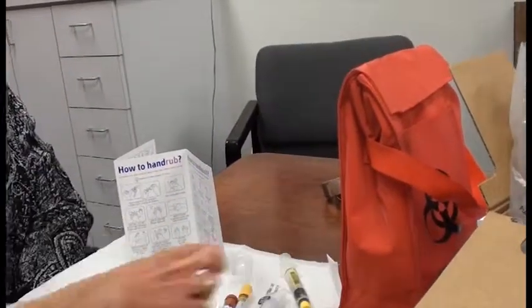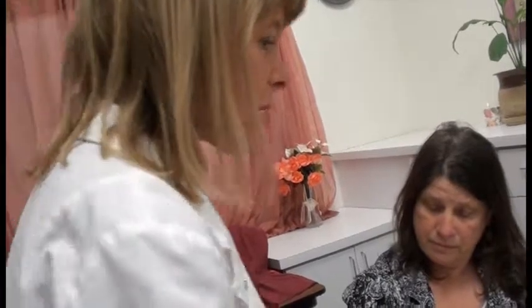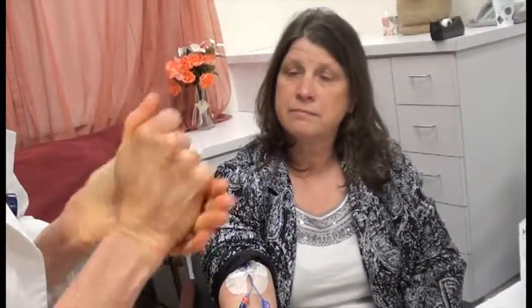If you find heparin in the home, and you've identified it's a valved catheter, what are you supposed to do with that heparin? That's right, take it out, bring it to pharmacy. If you leave it in the house, somebody's going to be using it, so we don't want them to use it. Also, alert pharmacy that that line is a valved line, and they don't need to be sending heparin out on this patient anymore. Okay, so I always like to redo hand hygiene right before I put on the gloves, just in case touching the environment happened and I contracted something from the table.